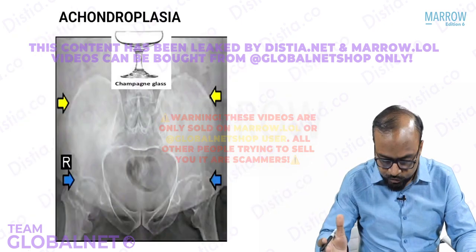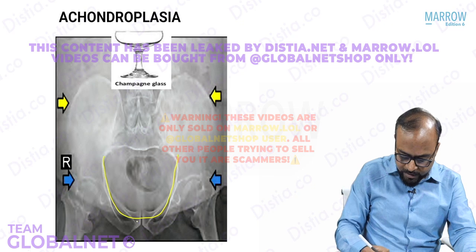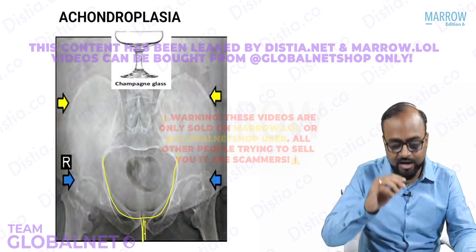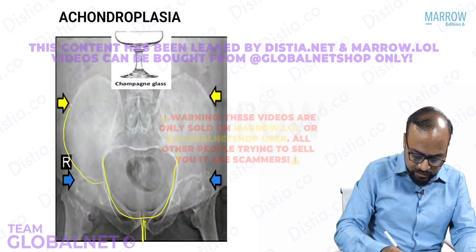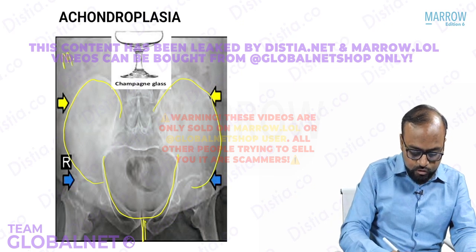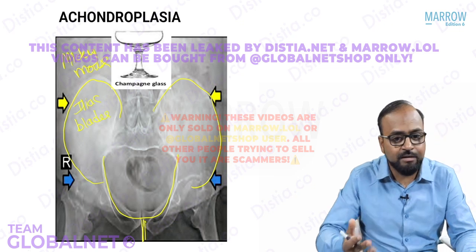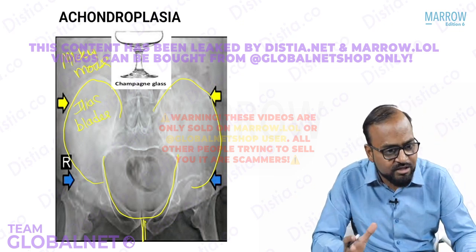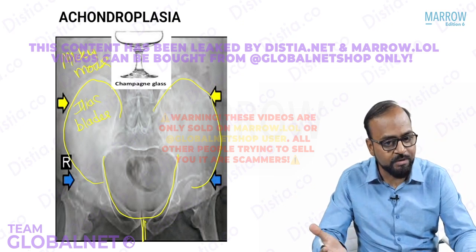The pelvis is also involved. This gives rise to a typical champagne glass appearance of the pelvis. Like a glass like this, this is called a champagne glass appearance. The iliac blades are very broad, wide. They look like the ears of a Mickey Mouse. So this is called the Mickey Mouse iliac blades. Okay, champagne glass pelvis, Mickey Mouse iliac blades. So these are features of achondroplasia.